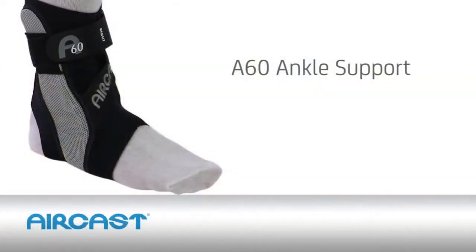The A60 stabilizer is available in left or right versions and three sizes. Be sure to specify your shoe size when ordering. Try the A60 risk-free with our money-back guarantee. Our knowledgeable brace coaches are trained to help you find the right brace for your needs.